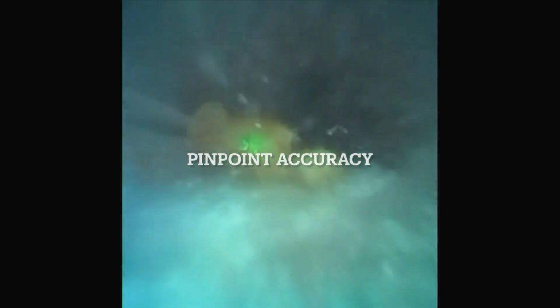And we laser the center of the stone with the TFL laser. Now, the TFL laser has gotten a bad knock, sometimes saying it causes more ureteral trauma, but I think that's more related to settings and to technique. Staying in the center of the stone under direct vision here with this small caliber ureteroscope, you can see the vision is excellent, and we can fragment the stone with pinpoint accuracy.